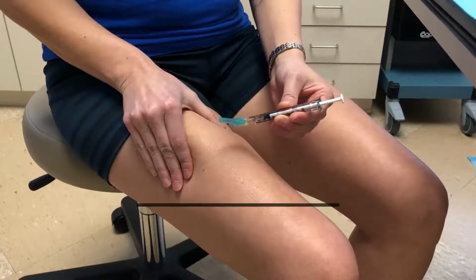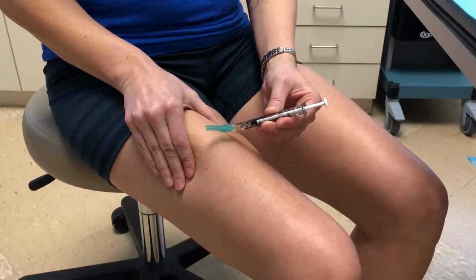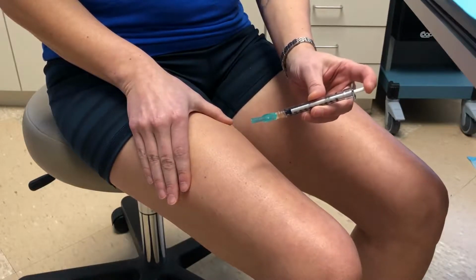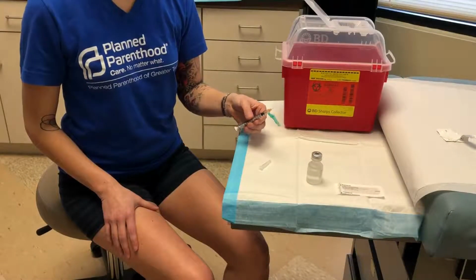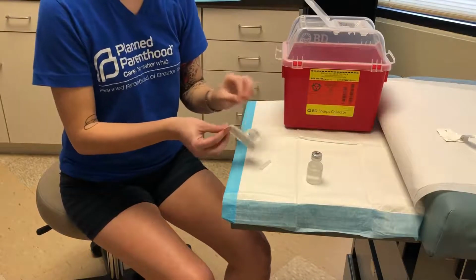You want to insert the needle 3/8 to 5/8 of the way in. In a smooth motion, insert your needle into the skin, push the plunger all the way down, and pull the needle straight out. Immediately cap your needle on a flat surface, dispose in the sharps bin, and apply your Band-Aid.